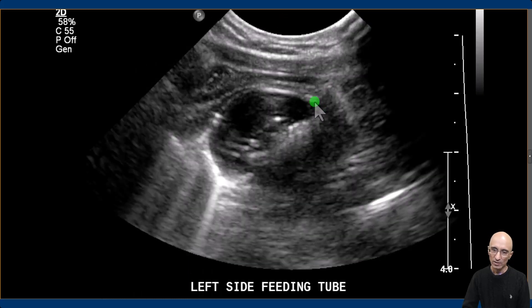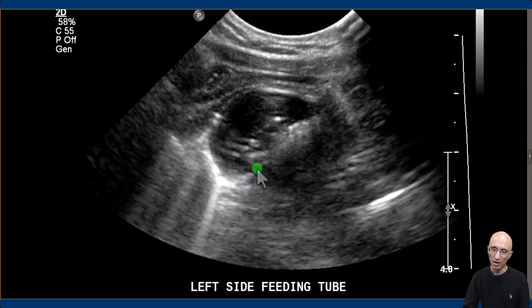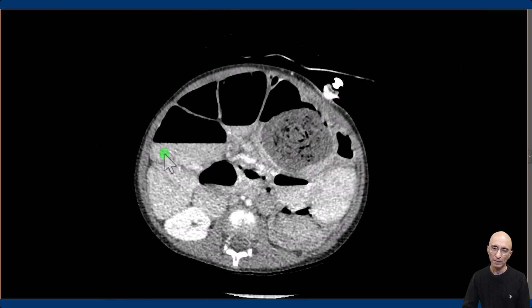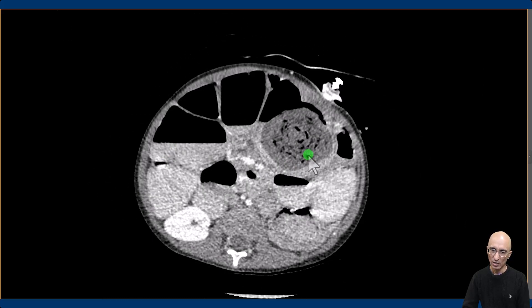On the ultrasound examination, immediately adjacent to the percutaneous gastrostomy tube, there was an arc-shaped surfaced lesion with posterior acoustic shadowing, which was indeterminate. The patient underwent CT examination for characterizing the soft tissue density lesion.